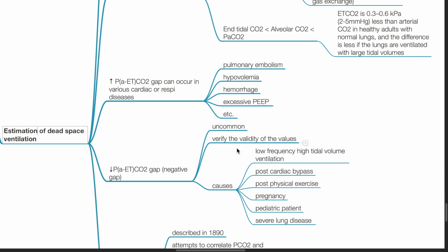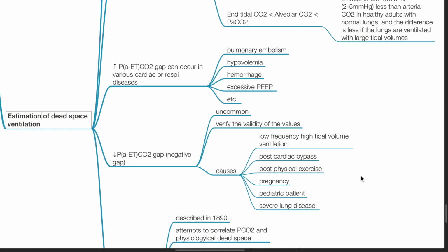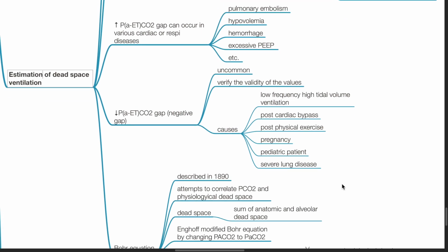Firstly, verify the validity of the values. Possible causes include low frequency high tidal volume ventilation, post-cardiac bypass, post-physical exercise, pregnancy, pediatric patient, and severe lung disease.